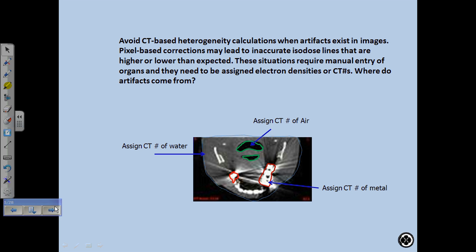Well, here, let me draw it. So here's the PTV, and you've got some bowel, an intersection. And this area was white because there was some barium in there. But now you've assigned this a CT value of 1. But this red area, this PTV, that's already 1. So now it's not using the CT numbers to calculate heterogeneity. Okay, so that would be fine?